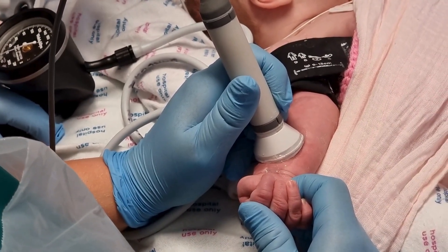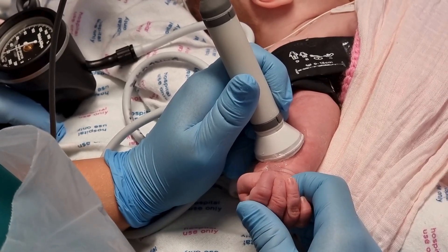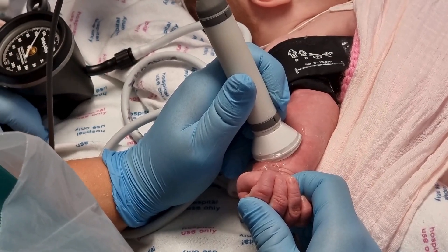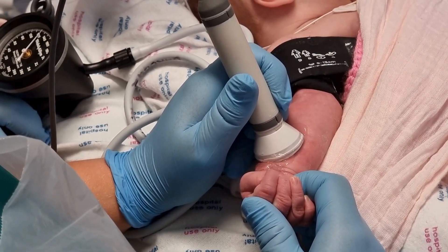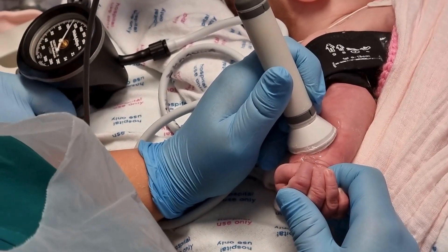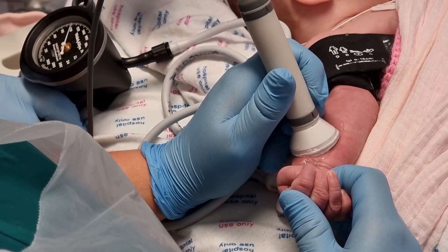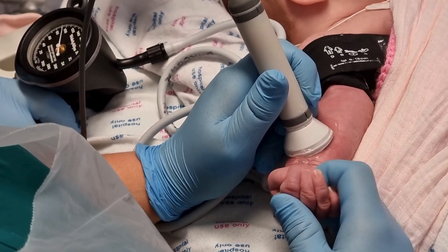Identify your radial pulse with your Doppler and then slowly begin to increase your blood pressure cuff until the pulsation noise is lost. Once your pulsation noise is lost, inflate your cuff to about 20 above this and then slowly begin to reduce. Once your pulsation noise has come back in, this is the measurement of your systolic blood pressure.